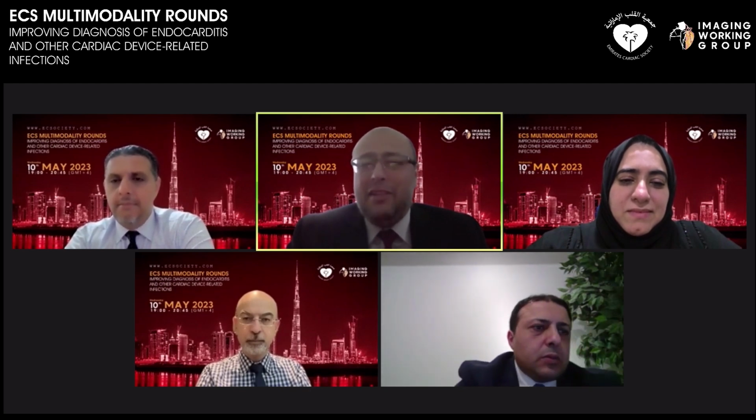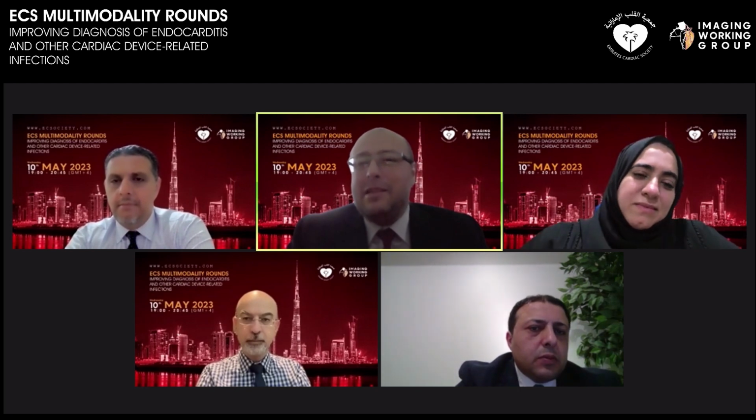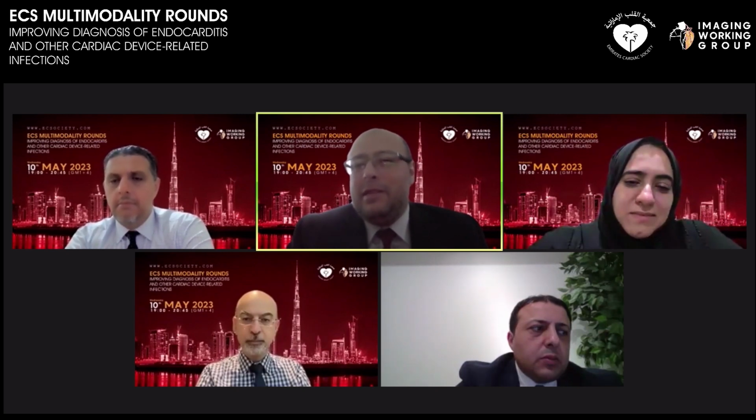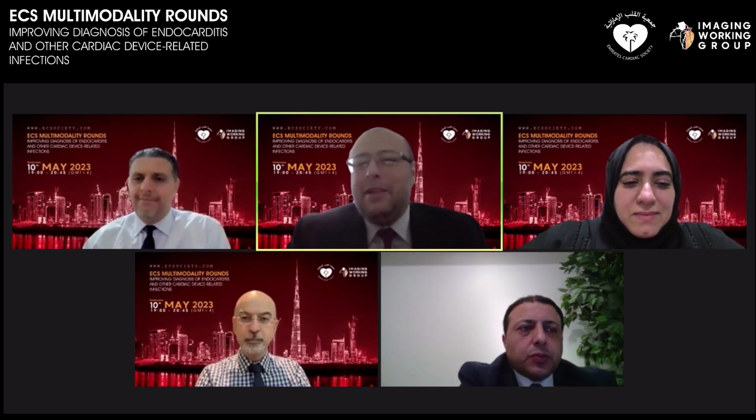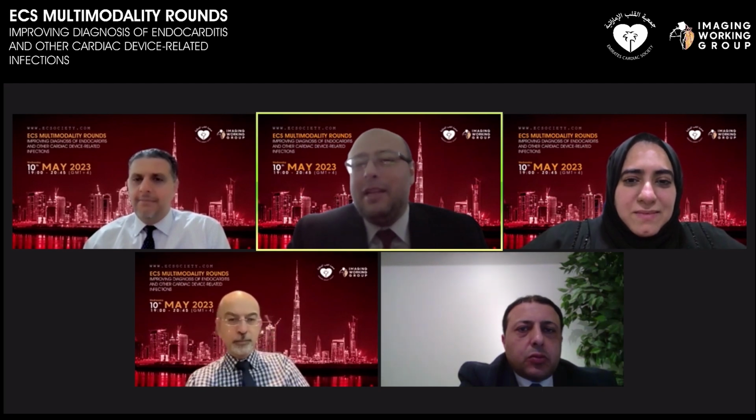Now for infection, I'm a little bit less stringent. It depends on what I'm looking for. If it's aortic valve, mitral valve, I usually want to be well suppressed. But if it is a pacemaker device or LVAD, usually the contact with the myocardium is much less. So I usually just fast these patients, and they are usually sick, so I don't want to torture them or give them a very hard time while doing this. So usually we go easy on them.